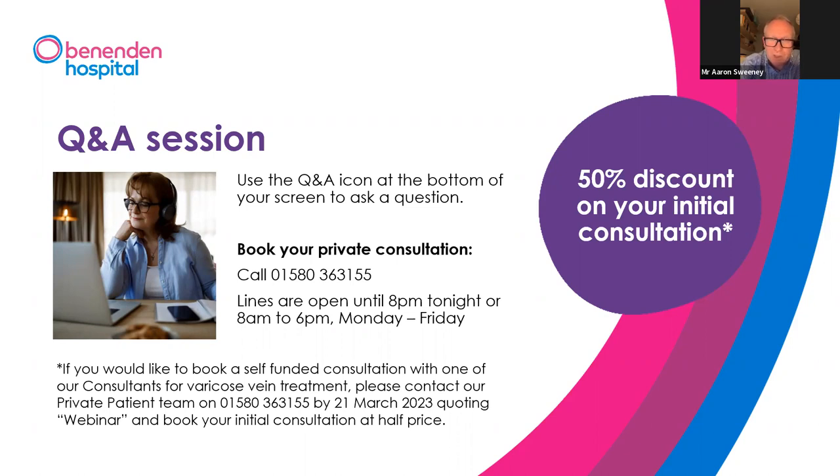When you laser that vein, it shouldn't come back. There's about a 1% chance of us not lasering the vein properly and it's coming back quickly. But for 99% plus of the time, that's the end. But depending on your age, if I laser someone's vein and they're 18, I will tell them that they have a 10% chance of another vein popping out somewhere that will need an operation in the future. So it's not technically a recurrence, but I describe it as a recurrence because it's a trip back to see a vascular surgeon. But the risk is about 1 in 10.